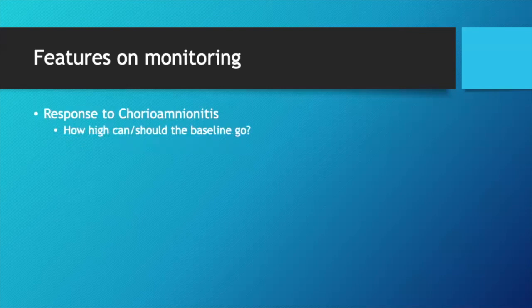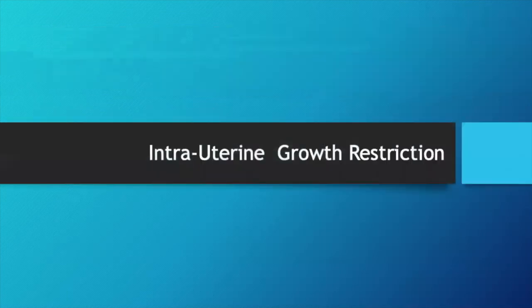Remember, all of this we've been talking about is the preterm baby. I'm not talking about an IUGR baby. I'm talking about a healthy preterm baby whose mom just happened to go into labor because she's ruptured her membranes, not showing signs of infection or any other signs. But an IUGR baby, or a growth restricted baby, is something that we also have to keep in the back of our mind. So similar to preterm, growth restriction is an important thing to keep in mind.